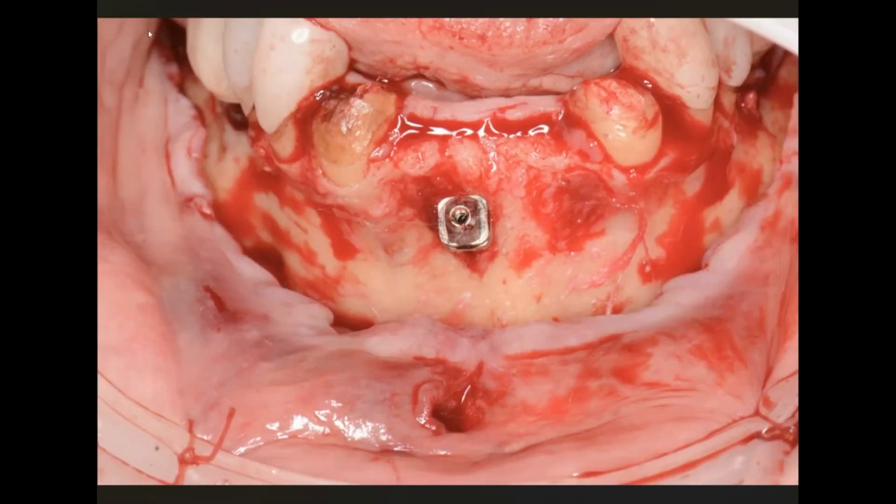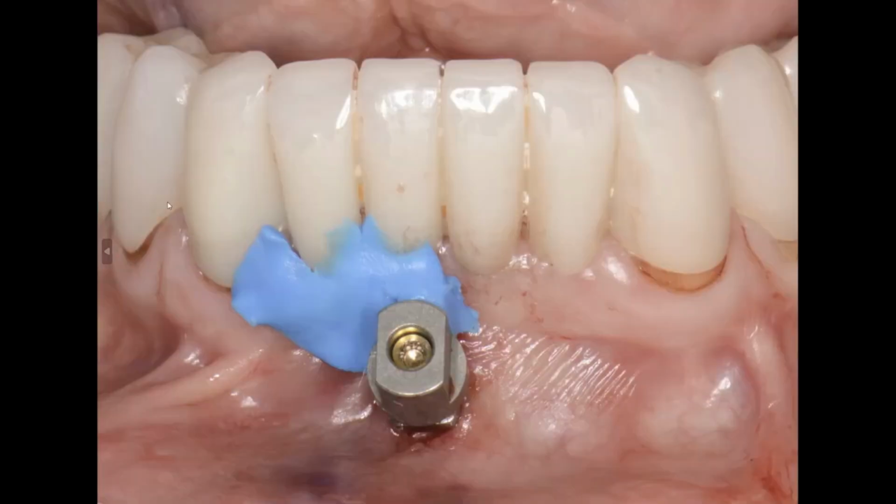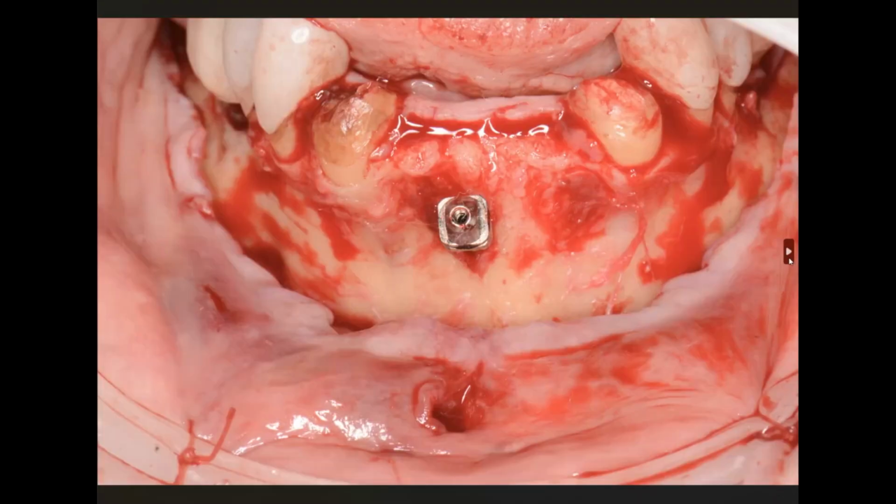And what we did, we did a scan. This is part of a bigger scientific paper that we're getting ready to publish, but we scanned the midline back, my technique, and then we scanned from 17 to 32, and then we took a scan from 32 to 17. And just to show you how poorly they all align.